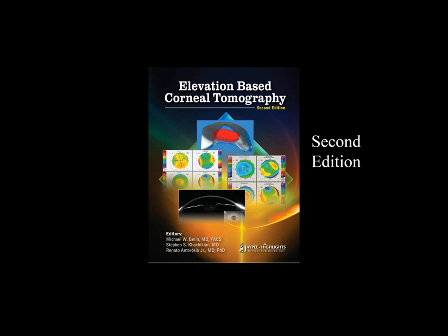So if you preserve good quality vision, waiting until you see changes on the anterior surface and then progression is basically waiting until they already had degradation in vision. So I look at anterior, posterior, and corneal thickness, and I like to see changes in 2 of the 3 for true progression. But if I had a young patient that clearly had a posterior ectasia, a change in any 1 to me would be adequate.